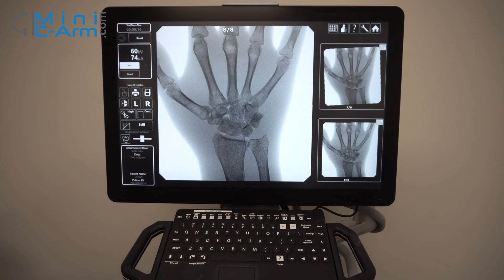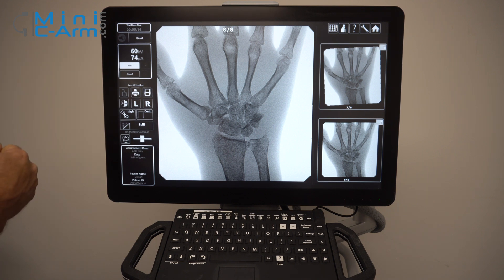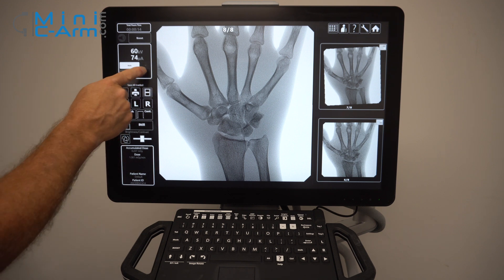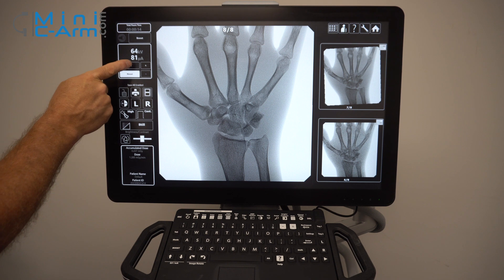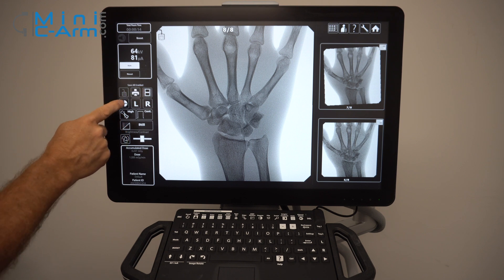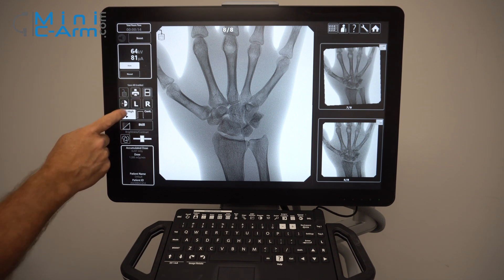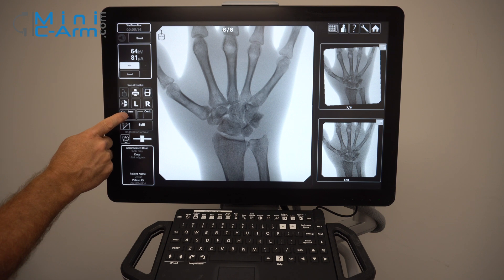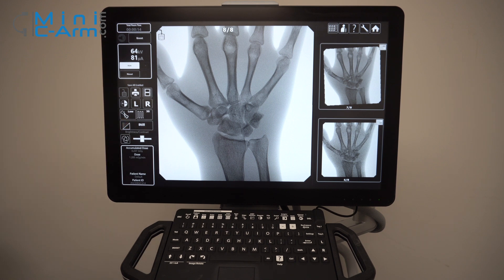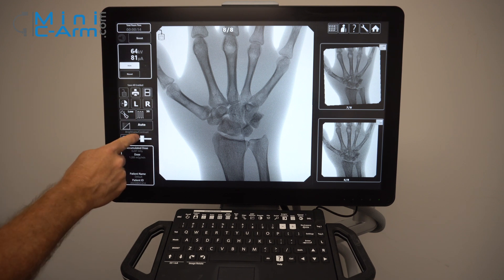Here are your touch screen settings for the OrthoScan FD Pulse. You have your boost button up here that allows you to go to 78 kV and 160 microamps, up from the standard 75 kV and 100 microamps. You can also manually adjust your technique using these buttons and go back into auto. Here's your save button, print, your cine loop, your negate button, your right and left tags, your high edge, off, and low. Here's your continuous and your pulse, which gives you three to four different pulse rates. Here's your noise reduction, and your brightness and contrast.